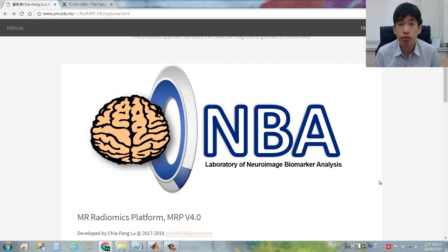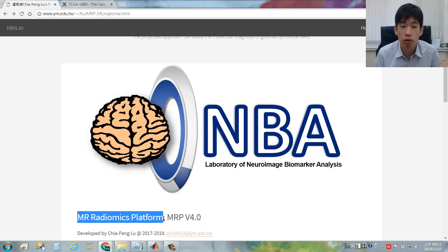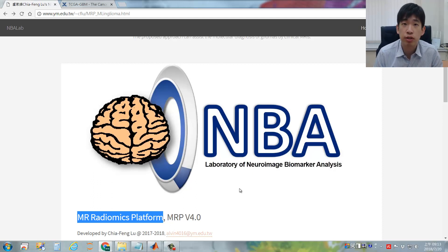This is the instruction video for the MR Radiomics platform. In this video, I will show you how to create regions of interest on multimodality MR images using this platform.